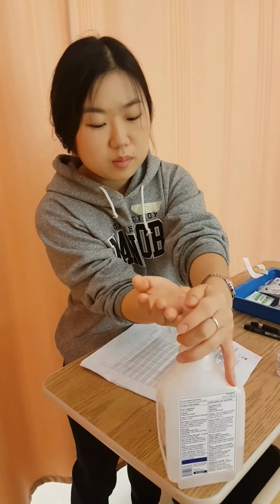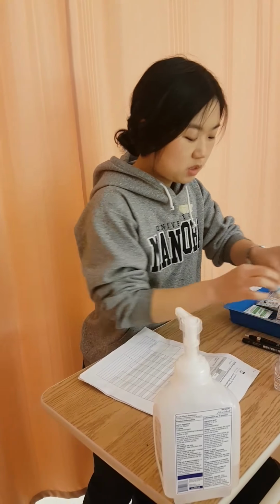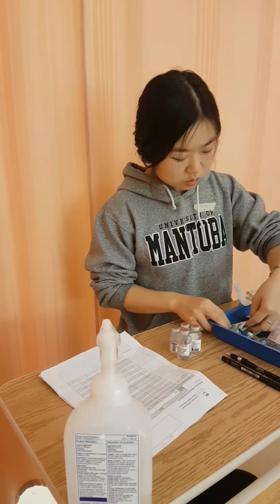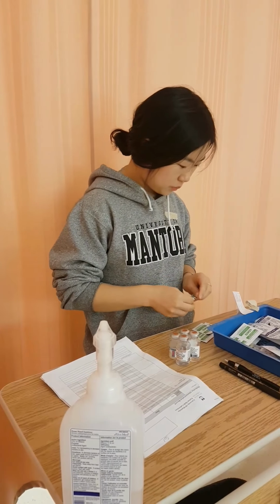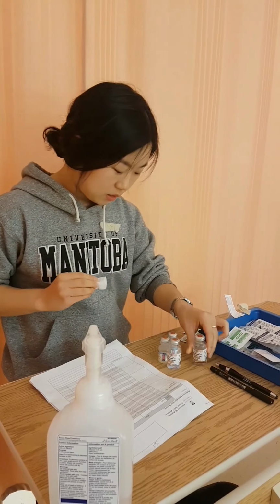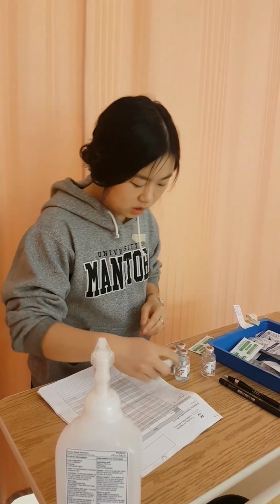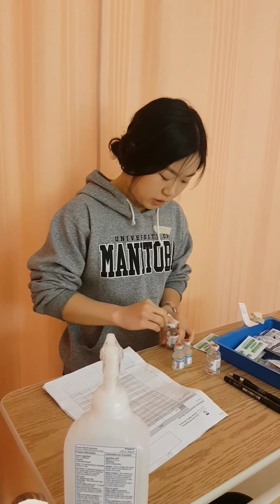Now, before I prepare my drug, I'm going to do hand hygiene. I'm going to take out my sterile waters, and I have my vials. I'm going to alcohol swab each of these vials. So for 30 seconds, I'm going to swab the top, and then let it dry for 15 seconds. And for the sake of time, I'm not going to rub it for the complete 30 seconds.